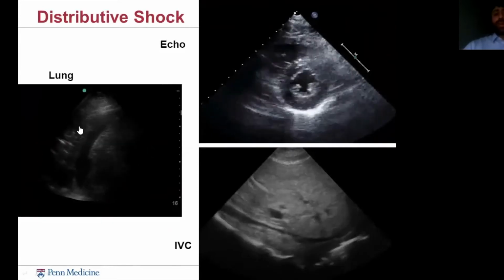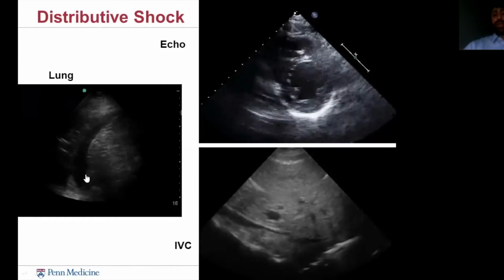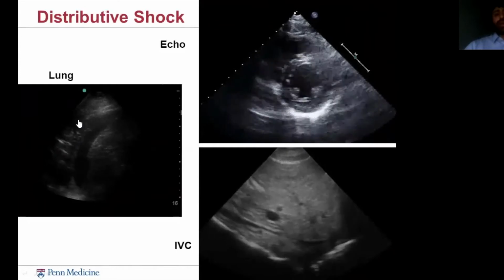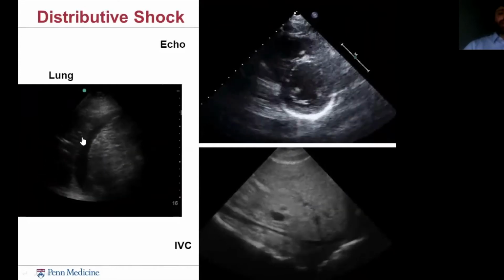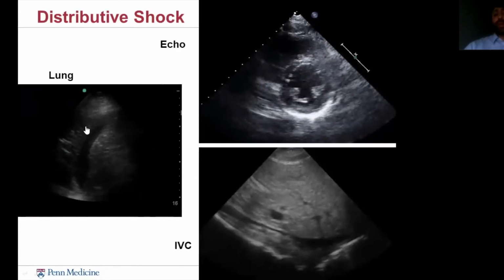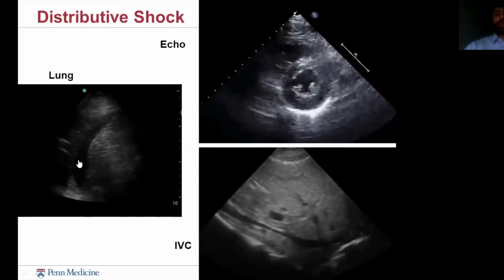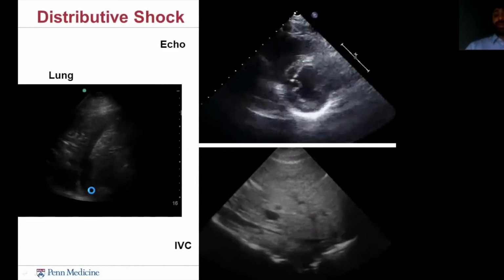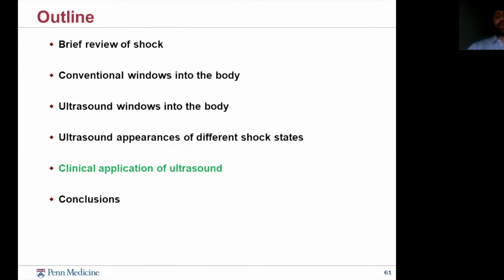But you can use lung ultrasound to frequently make the diagnosis of pneumonia, and what you're seeing here is consolidated lung on the left-hand side of that lung ultrasound screen, in that it looks like liver, with a thin pleural effusion, a parapneumonic effusion in this case. This also demonstrates dynamic air bronchograms, a specific finding in pneumonia.